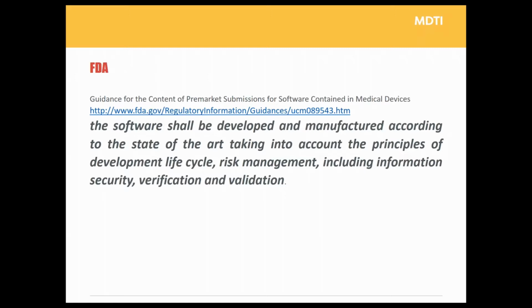And what makes my heart sink when I come into a new potential client is that it's very, very important to get the environment and the elements of your software development established before you start writing software. If there's one thing you take away from this today to help you on your way, it is: define, get control before you start writing software. It's too late to try and retrospectively apply these controls and disciplines after the code's been written.